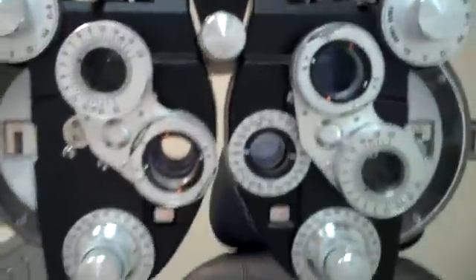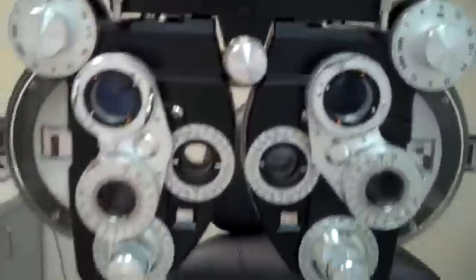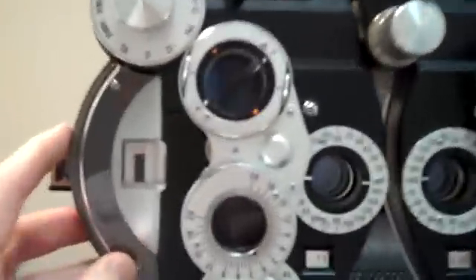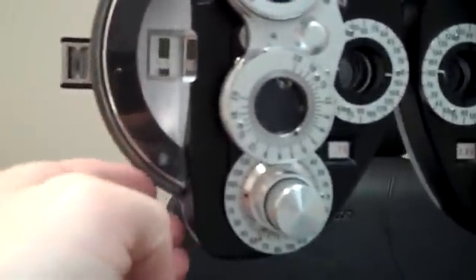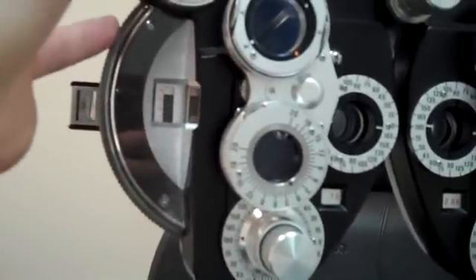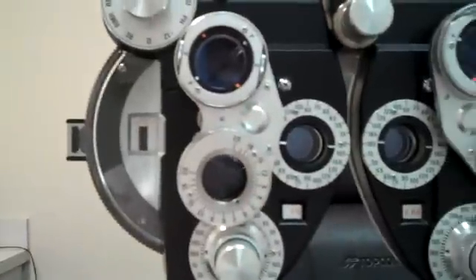Let me show you a little bit about the Foropter. This is what I'm looking at when you're looking through those little binoculars. I'm looking for three things for most people. This is how much nearsightedness or farsightedness you have. One way is going to show me whether it's going to be weaker or stronger. That's the easy part.